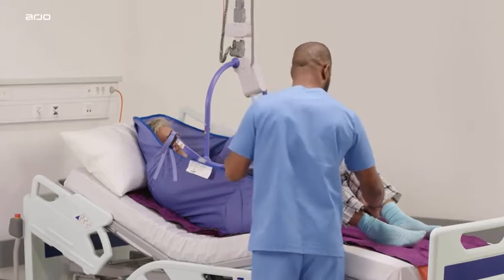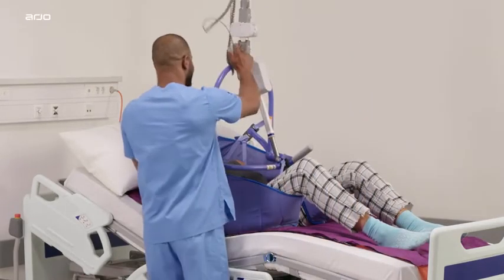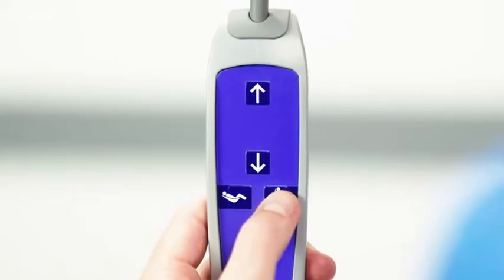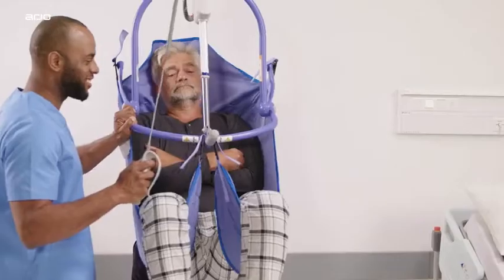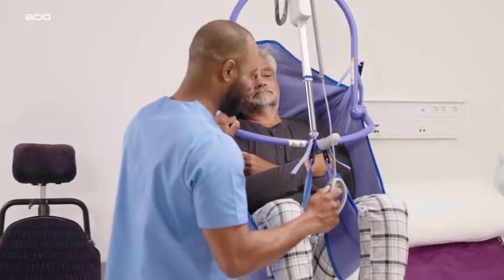The PDPS spreader bar enables patient positioning maneuvers to be performed with minimal physical effort by the caregiver. To stop any powered movement, release the control button. The spreader bar will remain firmly in position once powered movement has stopped.